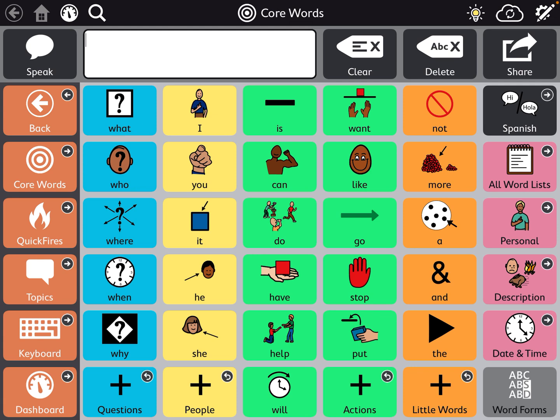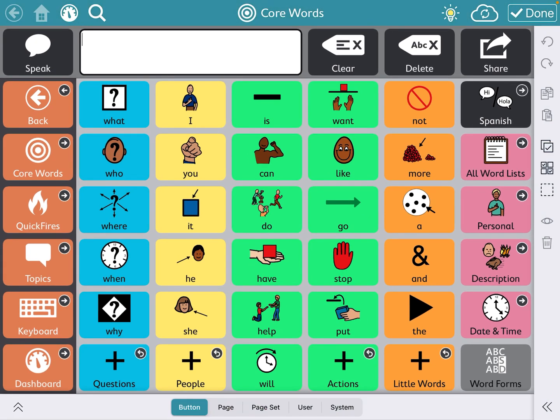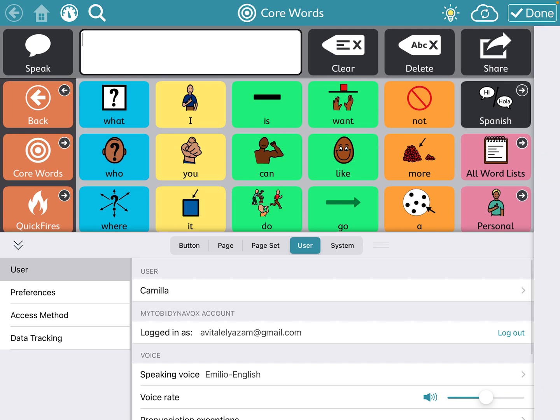That gets you to MyTobiiDynavox.com and lets you make a parent account. You want the parent to confirm their email. If you're logged in, go to the top right-hand corner where the pencil is, then go to User — you'll see you're logged in. If you're not logged in yet, you would log in at that point, and that way your stuff can be backed up and shared remotely.